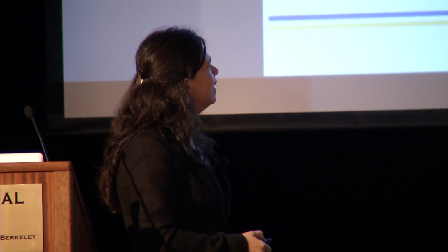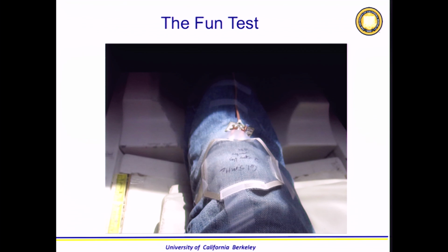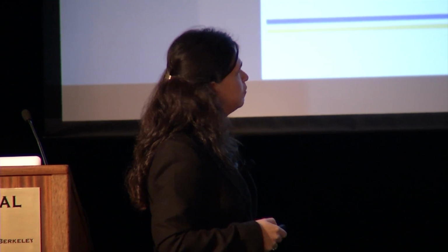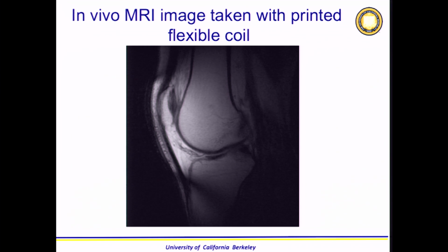The fun test, of course, there's a student, there's an MRI machine, this is inevitable. So, of course, he said, oh, let's get an image from my knee. So there it is. You can see how this is done. I find this amazing. It's a piece of plastic with 3 layers of printed materials. And then we connect it to the machine, and off he goes. And these are the type of images we get. This is a very healthy 23-year-old knee. Of course, the image is much better here, but I think you get the point.